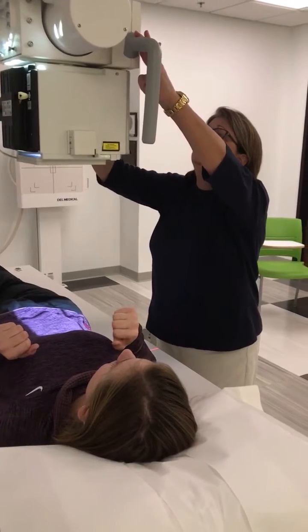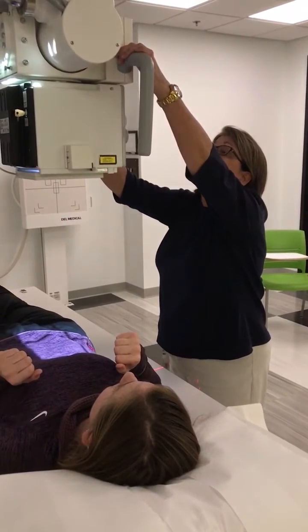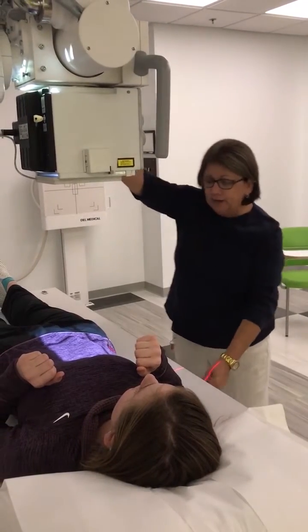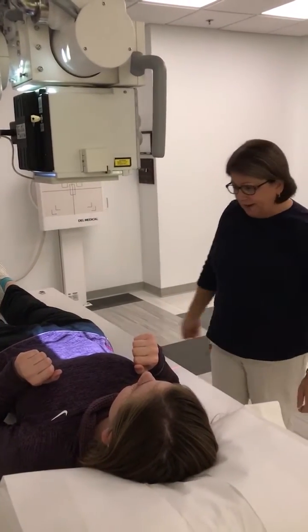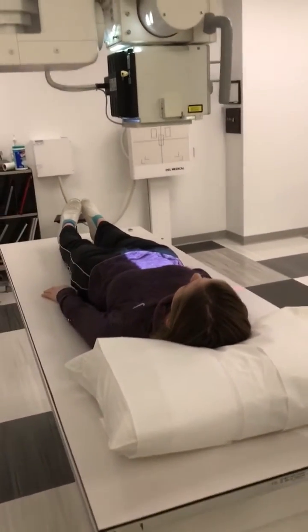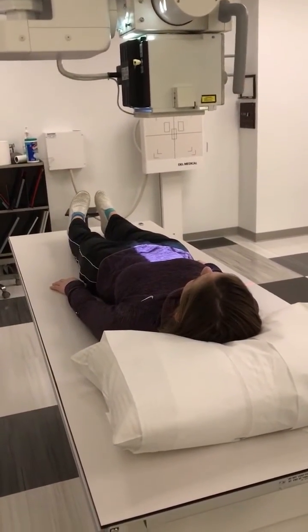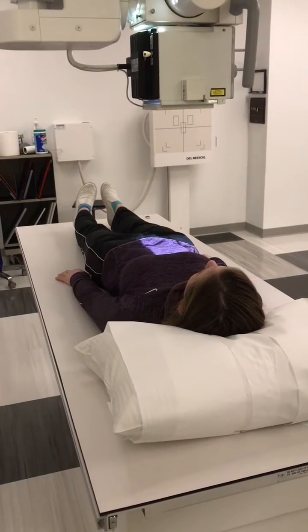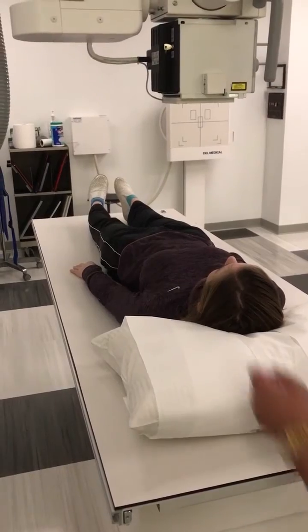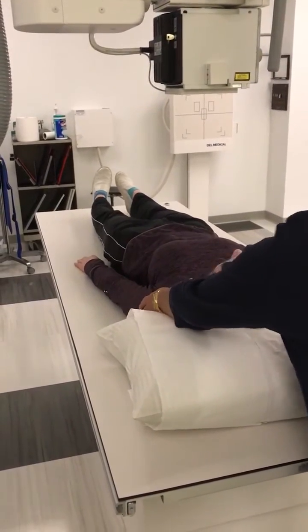Bring the tube. We want a 40-inch SID. The closest readout on this equipment that we're going to get is 40.2 or 39.8. I want to make sure that my patient is centered on the table and straight on their table. Ma'am, can you move your shoulder slightly to the right? Just a little more. There we go.